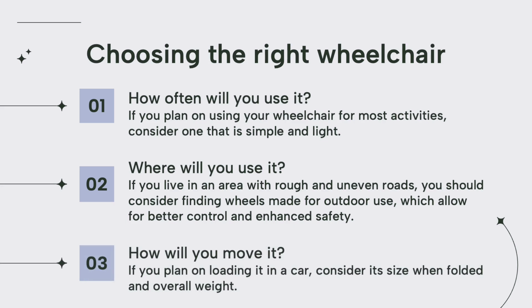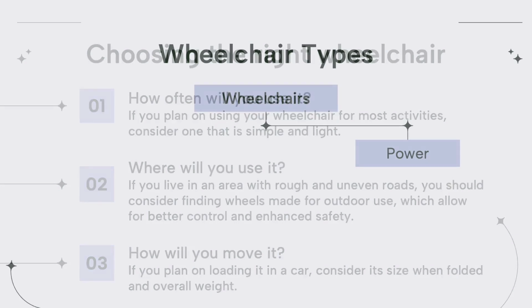How will you move it? If you plan on loading your wheelchair in a car, consider its size when folded and overall weight. If it's too heavy, you may have a hard time lifting it in and out of your car.